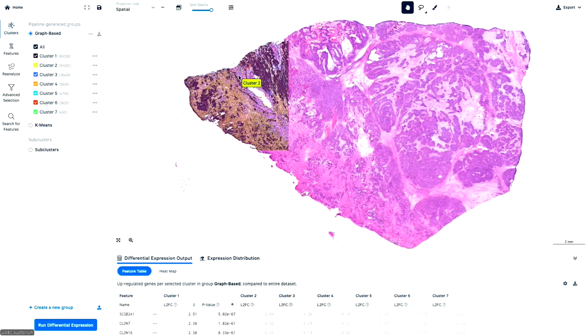The authors used FFPE blocks to profile nuclei, and they identified, and this is published in Cell, an immune exclusion signature that they are thinking about using as a biomarker. And they showed a very nice correlation with survival. So sure, you don't have the full representation, but in most cases you look at the true biology of the sample.